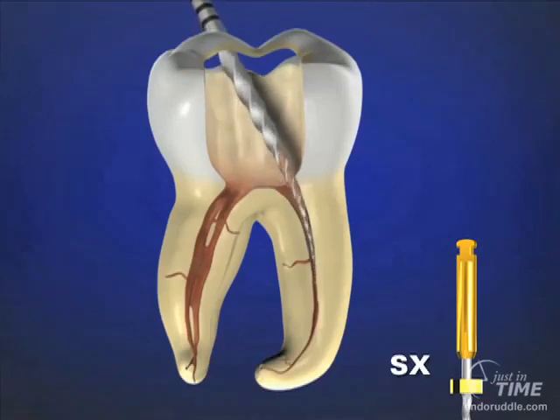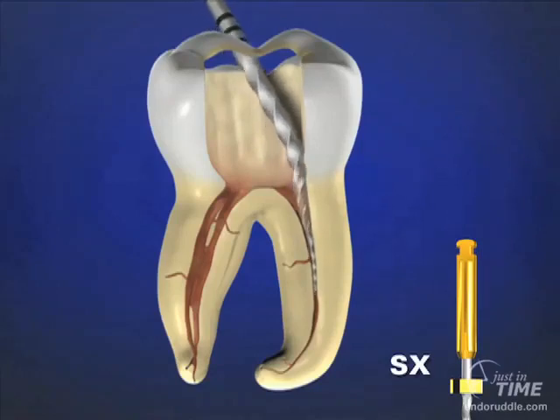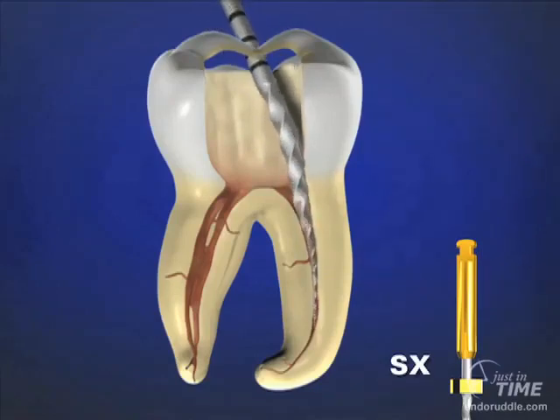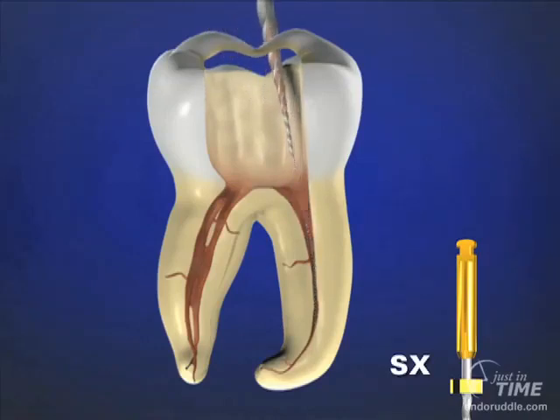There should be enough working width to accommodate its working end. And the end is just the steering wheel on the nickel titanium car. It steers the instrument through curvature, but you're pushing the workload up to the bigger, stronger, and more efficient blades. That's a very effective way to pre-flare the orifice and begin to remove restrictive dentin from the coronal 1/3 of any root.